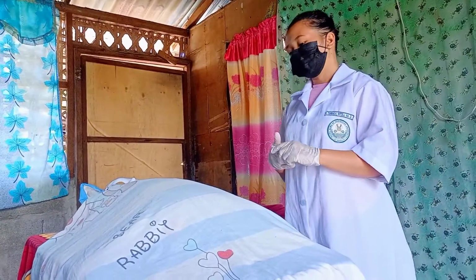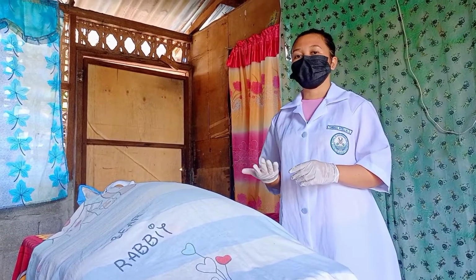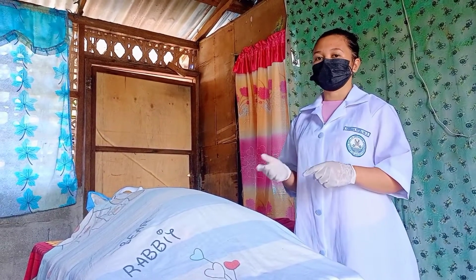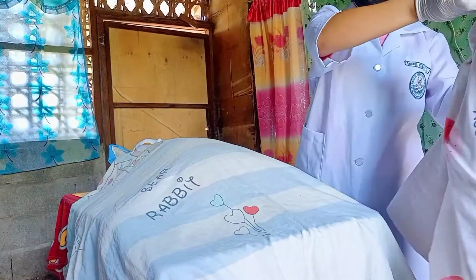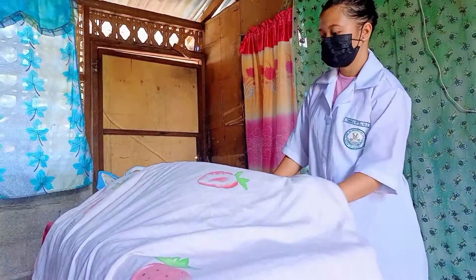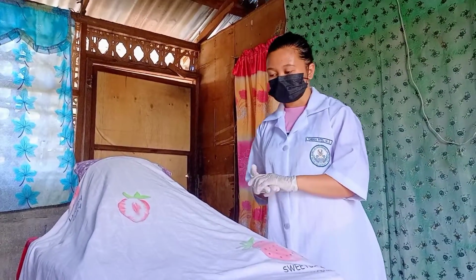And also, I put a bath blanket on my patient. So for women, fold the blanket in a diamond shape. Wrap the corner around the client's leg and fold the upper corner down over the perineum. And also for men, cover the client's upper body with a blanket. Fold the bed sheet down to expose the penis. So now I want to expose the perineal area.